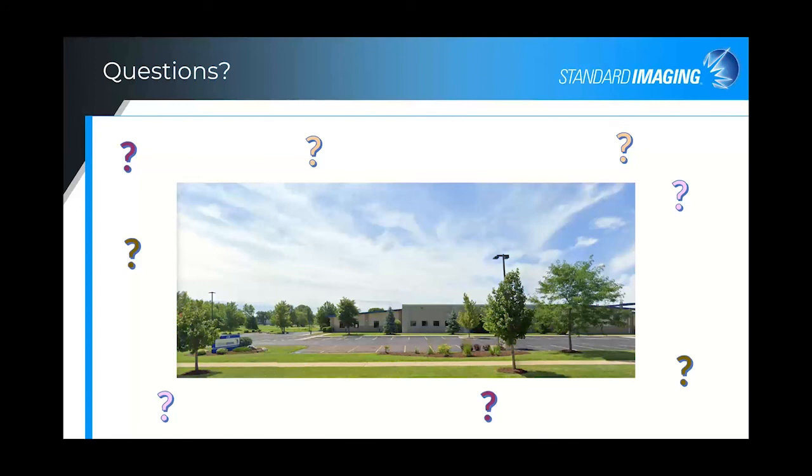And then based on those protocols, there is a matching of the density from the plan CT, is what I think you are referring to. So the CT values from the plan are transformed over to the CBCT. And so that's taken into account. If you'd like, I can go ahead and send you the publications describing that method in a bit more detail.